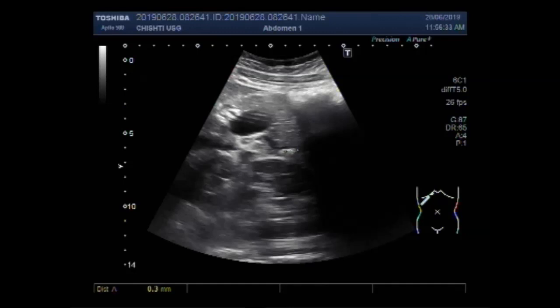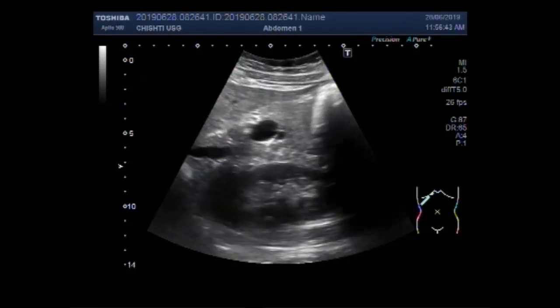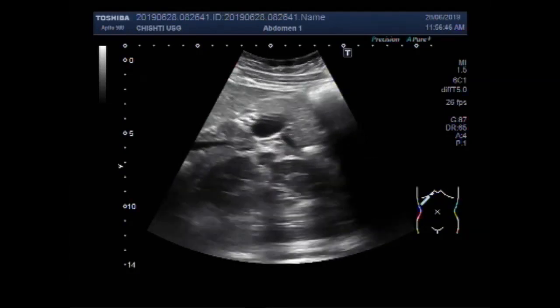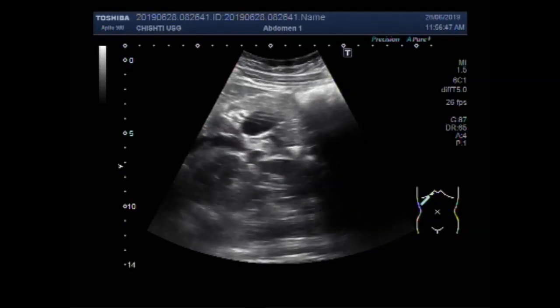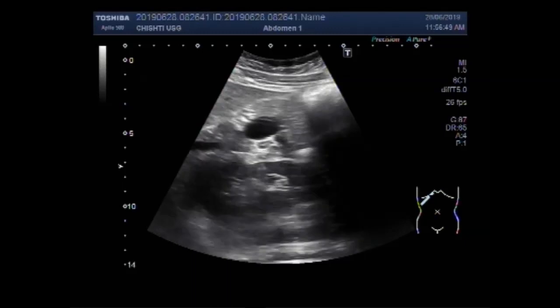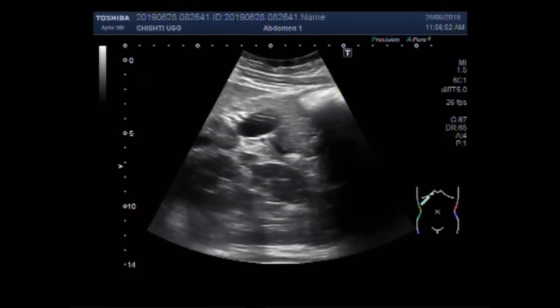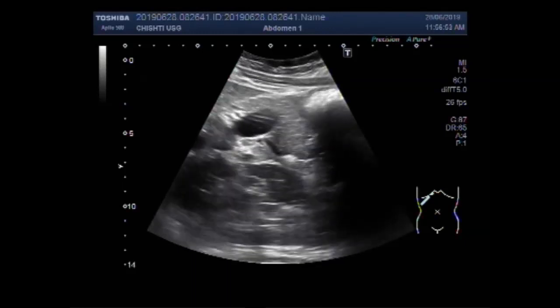Now this is the dilated biliary channel and a stone is seen in its interior. This stone measures about 14.5 mm. This is the stone.